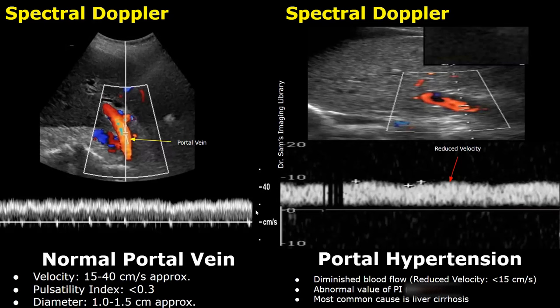The pulsatility index is approximately less than 0.3. The normal diameter of the portal vein can vary but it is usually between 1 and 1.5 centimeters.